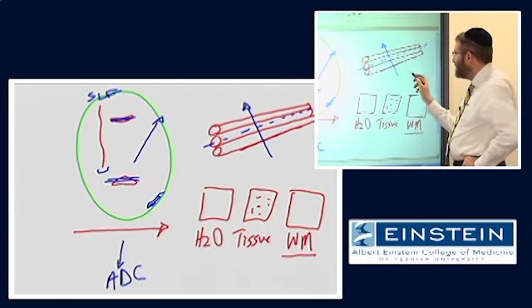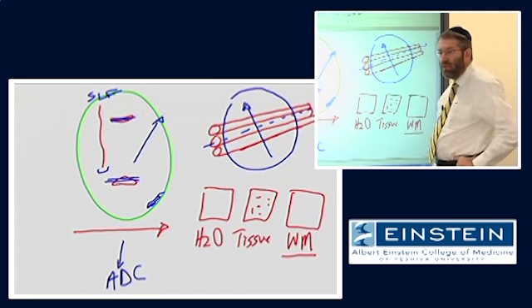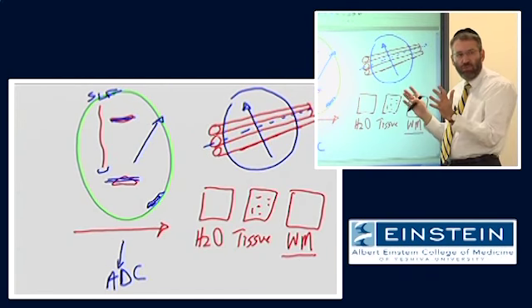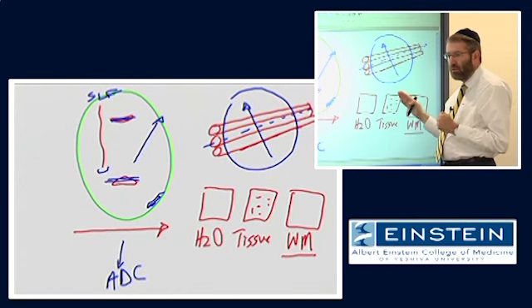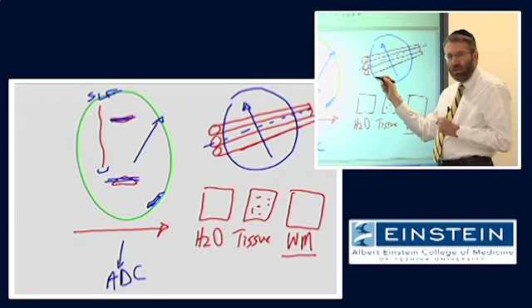But there is always a distribution. If there were a certain population of spins in this white matter bundle, there will be a distribution of directions of diffusion, such that some will be perpendicular, some will be parallel, and some will be somewhere in between. The preponderance in normal white matter will be along the axis of diffusion.